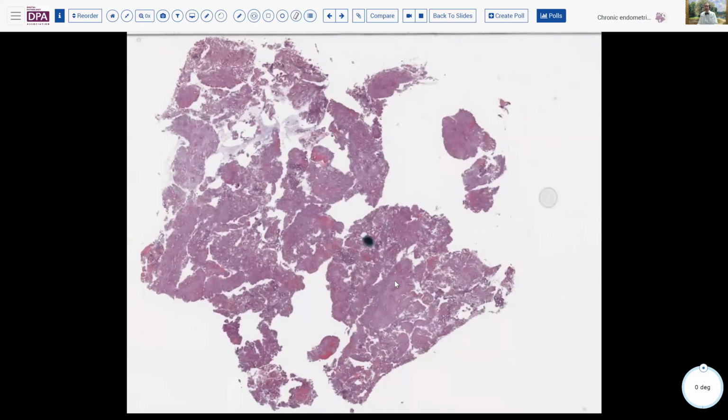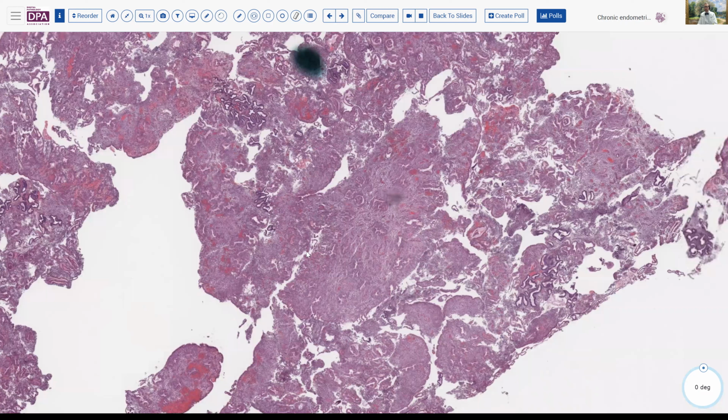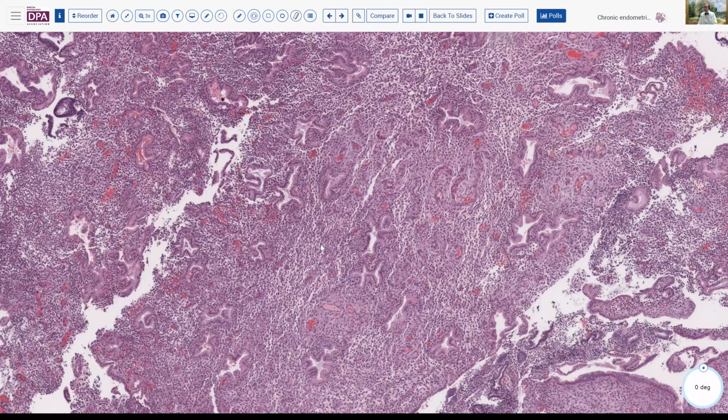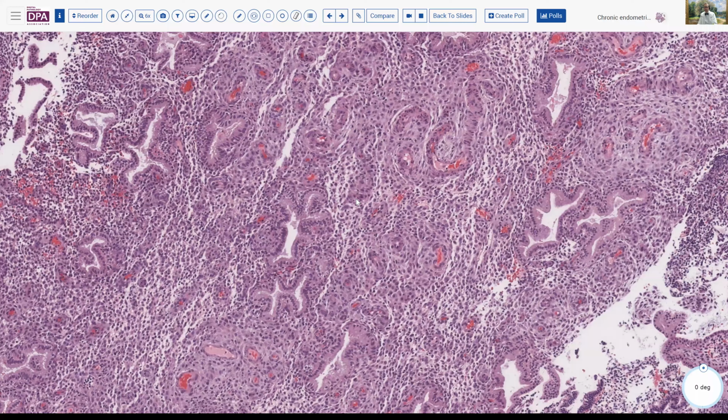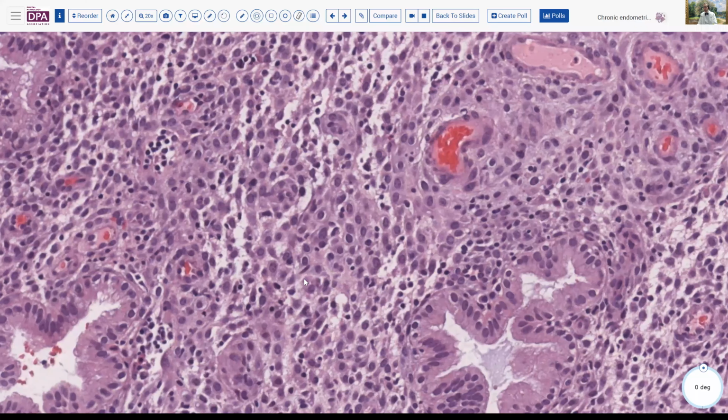One final example, this one I think is a little bit more abundant tissue. And in this case, as we look at this tissue, we actually begin to see another picture. So all the previous ones have been kind of proliferative-ish. This one looks much more like secretory endometrium and has kind of complex glands. You're beginning to see some predecidua around these vessels that would indicate that there's a normal cycle going on and that this may be approaching the time of menses, because as you get that predecidua, then you'll soon begin to detect inflammatory cells in the epithelium, in the stroma, that will begin to cause that breakdown.